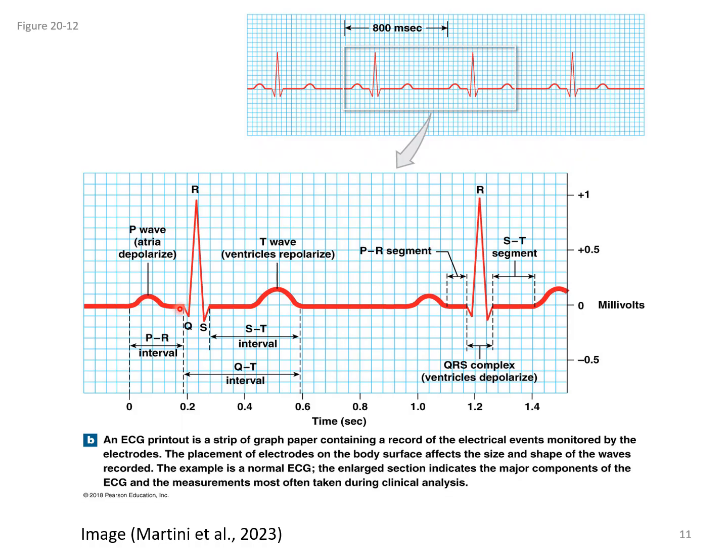Okay, and then as I said earlier, the P wave is for the atrial depolarization, the QRS is for the ventricular depolarization. Okay, but since the atrial repolarization happens within the ventricular depolarization, we cannot see it because it is masked by the QRS complex. And right here, as you can see, there is a T wave. The T wave is for the ventricular repolarization. So whenever there is a ventricular repolarization, you can see it, not the atrial repolarization.